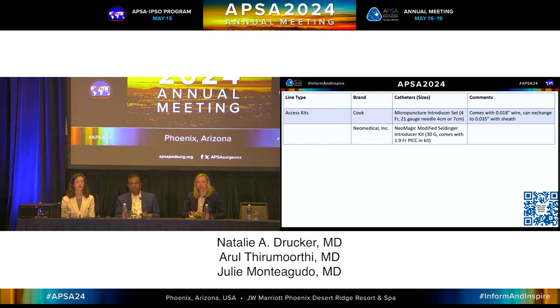I have found that to be clutch in so many situations when you're called and the kid is a pincushion and they can't get anything in. That little disposable UVC kit that all the neonatologists have has a nice vein pick, and I find that really helpful, especially when your trays are lost in SPD like ours are. I don't know, maybe it's just us.